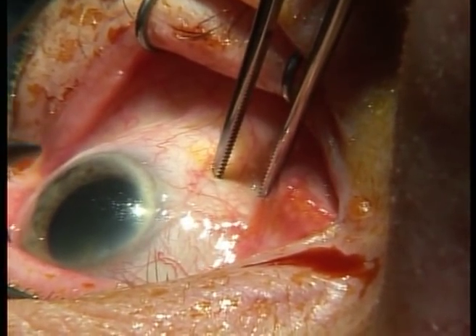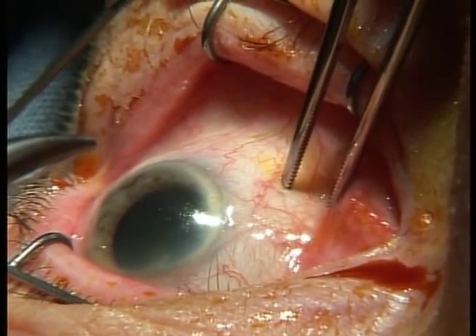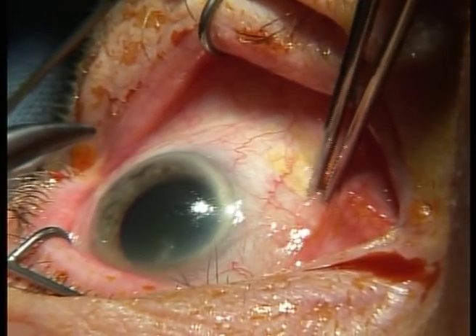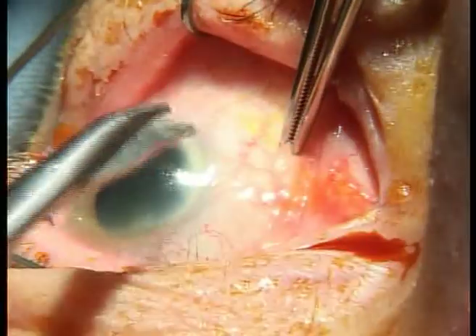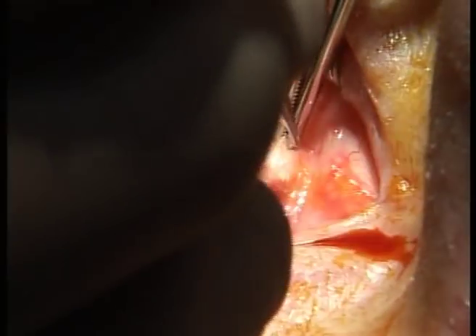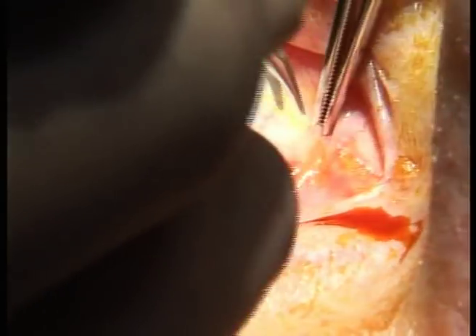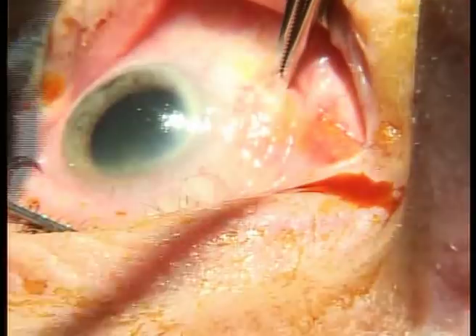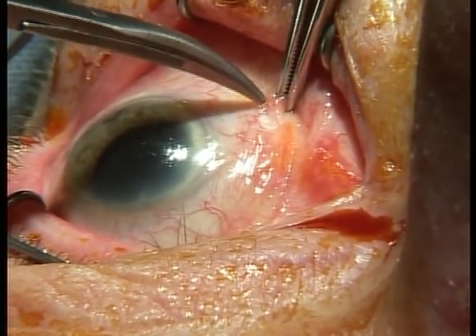Push into the globe slightly with your forceps before you pick up, and that way you'll get both Tenons capsule and conjunctiva. And now pick up. With your scissors, ensure that you come in perpendicular to the surface of the globe. Don't come in flat like this. Come in perpendicular and try to have your cut heading radially out from the globe, not sideways like this, but radially like that. I push in with the scissors and make a little incision.